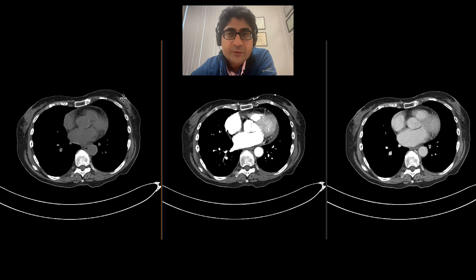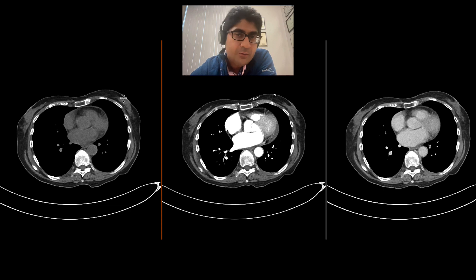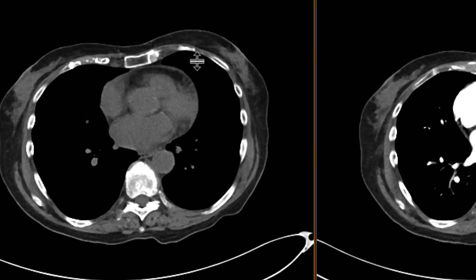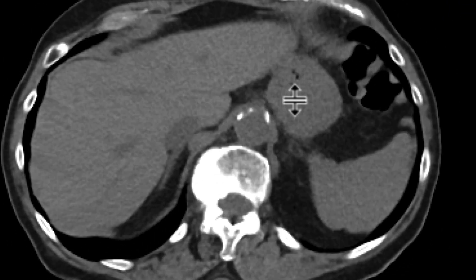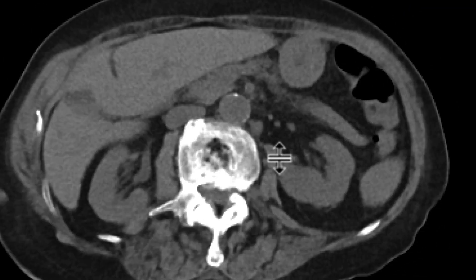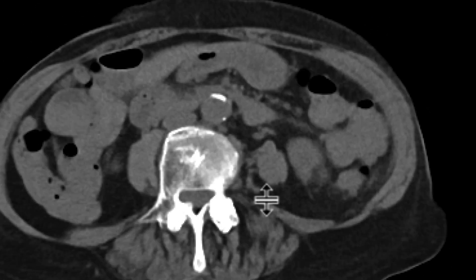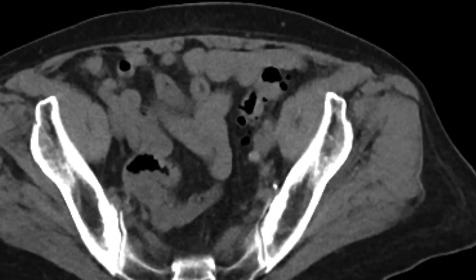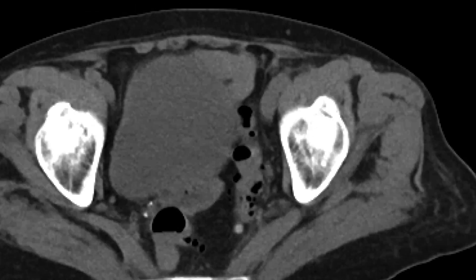This is a patient who comes in with concern for an active GI bleed. We do our GI bleeding protocol, which consists of a non-contrast study followed by an arterial phase and a more delayed phase through the abdomen and pelvis. Here we have the non-contrast phase as we're scrolling through, and we look to see if there's any high density in the bowel prior to giving the contrast.